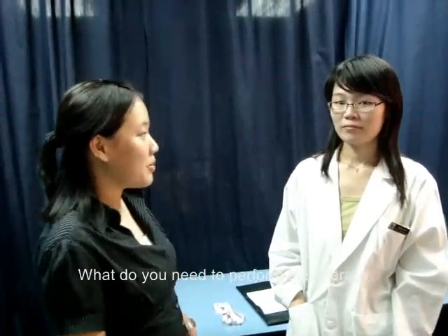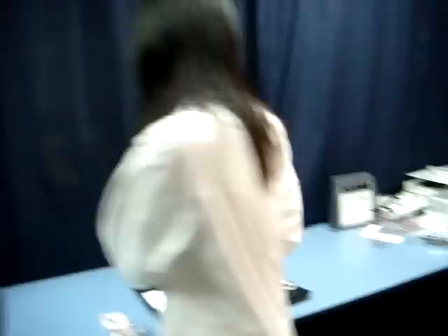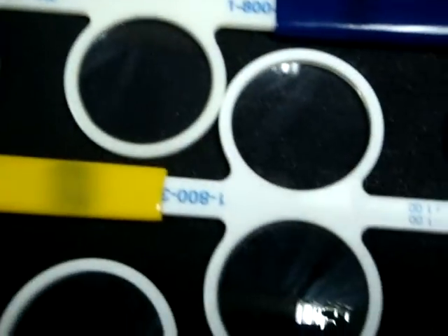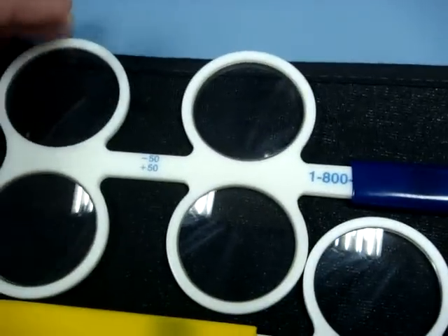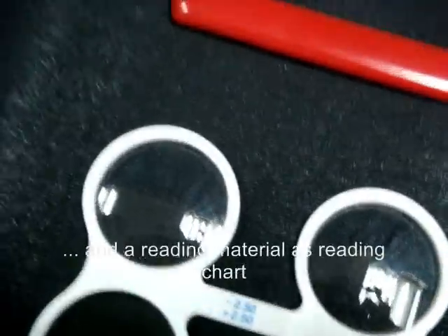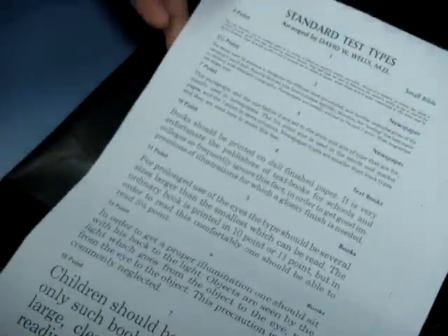What do you need to perform this therapy? We use the plus-minus flippers in various powers ranging from plus-minus 0.5 to plus-minus 2.5 in half-diopter increments, and reading material — specifically a reading chart.